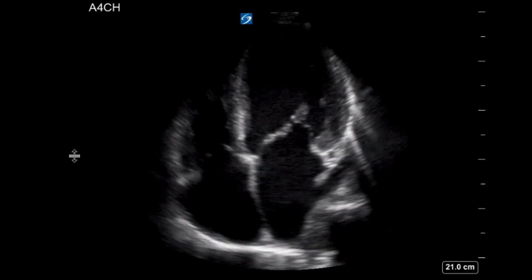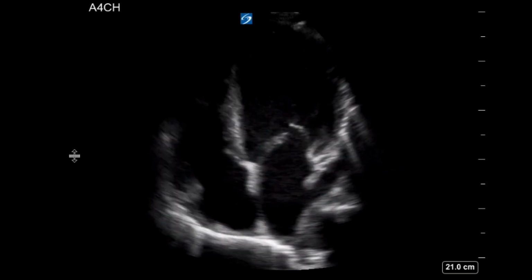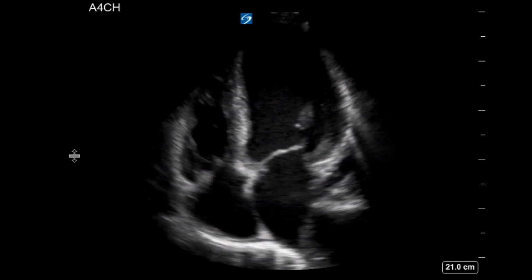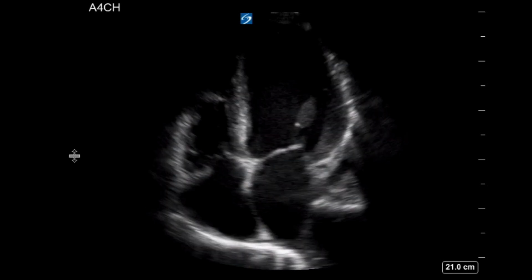Yeah, perfect. When that ratio approaches 1-to-1, you get more worried about right heart strain. And like you said, it could be chronic from pulmonary hypertension or chronic PE, but that is an abnormal ratio.